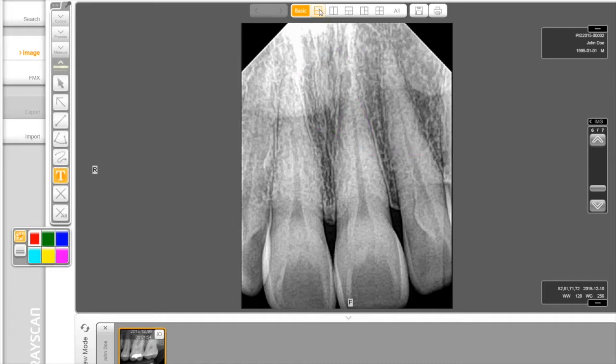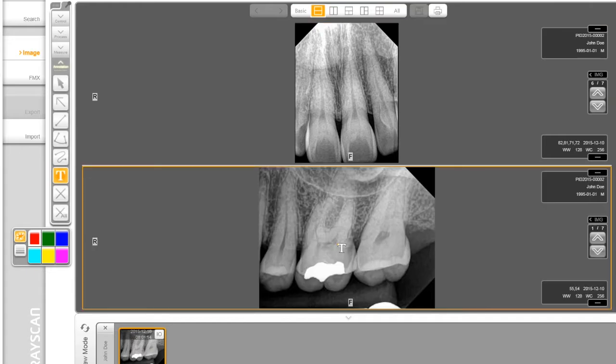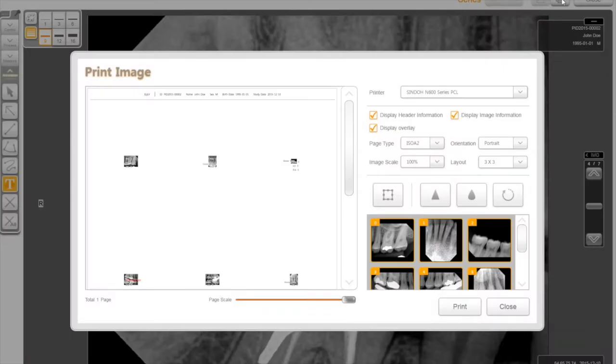The Compare Images function allows a user to view up to 5 images in a side-by-side comparison window. This tool allows drag and drop function. If you decide to save the adjustments, click on Save. Also, you can print by going to Report.